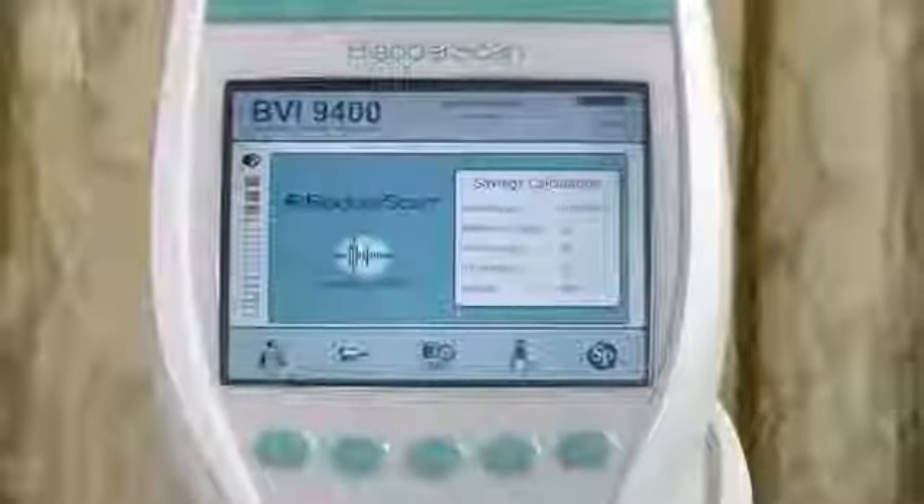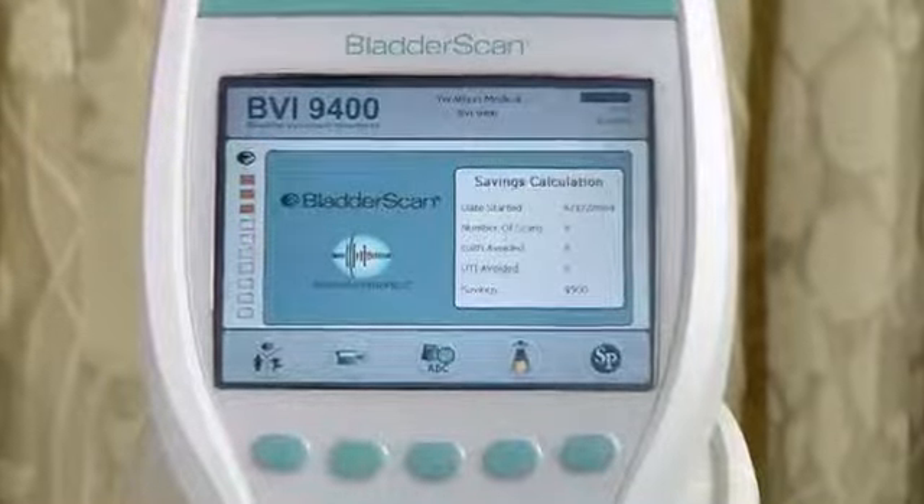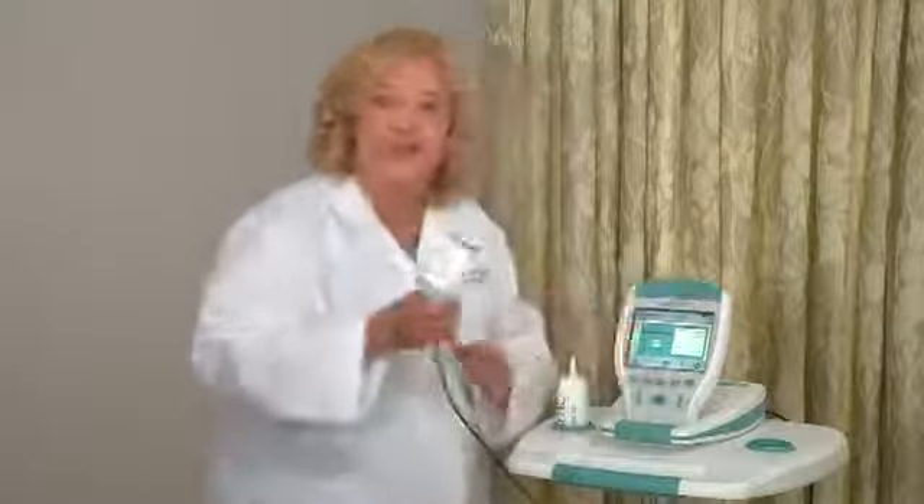It's also an important instrument to have in primary care practices so the physician can determine the amount of urine in the bladder in patients who are at risk for urinary retention. In both these settings, the bladder scan tells the staff the amount of urine in the bladder without instrumentation and complications that can occur from catheterization. The bladder scan BVI9400 is a battery-operated portable instrument that has a color display console.